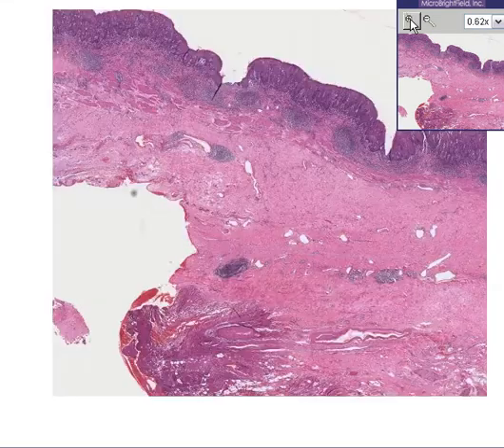Okay, now we'll talk about the next case called chronic esophagitis. Well, here we see a strip of tissue in which even at this power you could tell one end looks a little bit bluish or darker, and then we see a bunch of fibrous tissue, and then we see the other side of the wall. Well, let's blow it up.